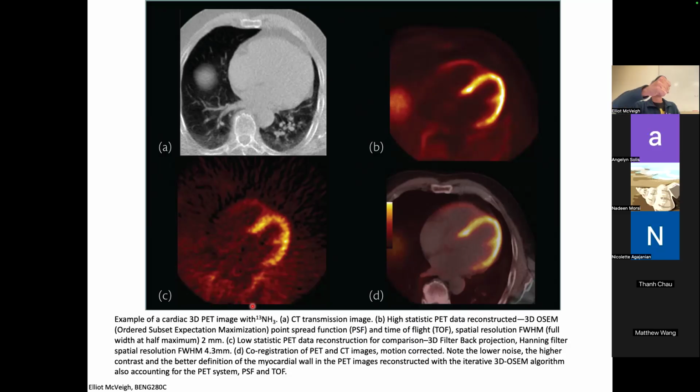So the model has come in and basically smoothed it. Then you adjust, given the difference between the raw data and your data, how do I have to change the picture to get my version of the raw data closer to this one, right? And so it's like a fitting procedure. I don't know if you've ever done iterative methods for just fitting a polynomial or a line or something like that. They just get closer and closer and closer, right?